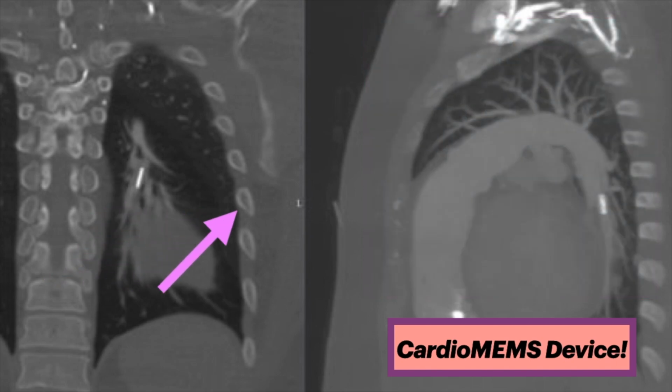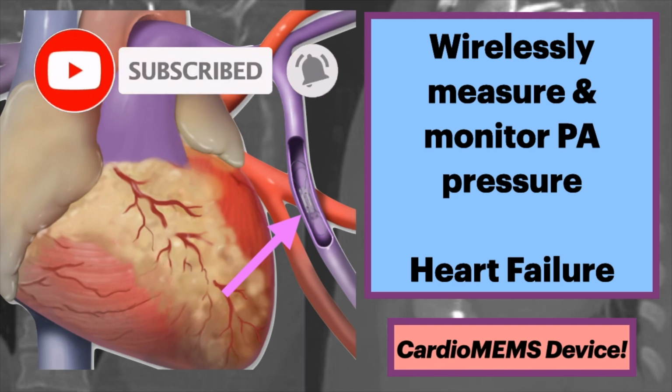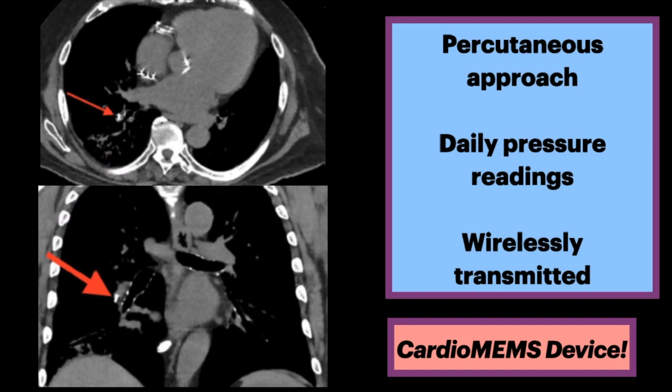What is that? This device is indicated for wirelessly measuring and monitoring pulmonary artery pressure and heart rate in heart failure patients who have been hospitalized for heart failure. Using a percutaneous approach, the sensor is implanted in the pulmonary artery. It's typically in the left lower lobe, but it can be implanted in the right lower pulmonary arteries, as seen here.